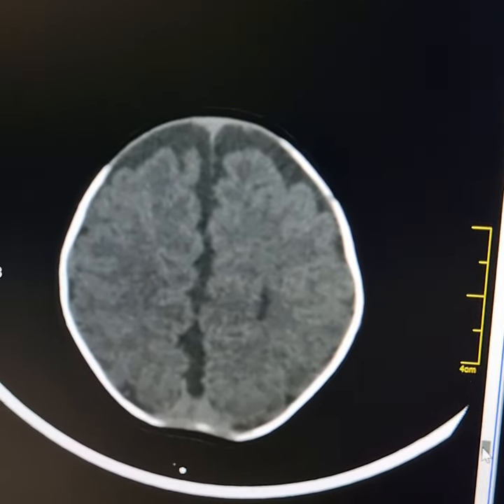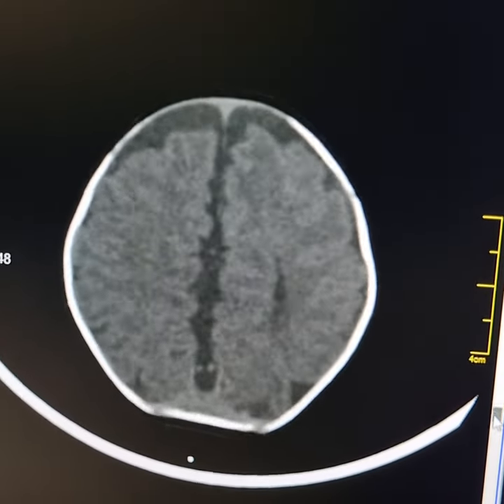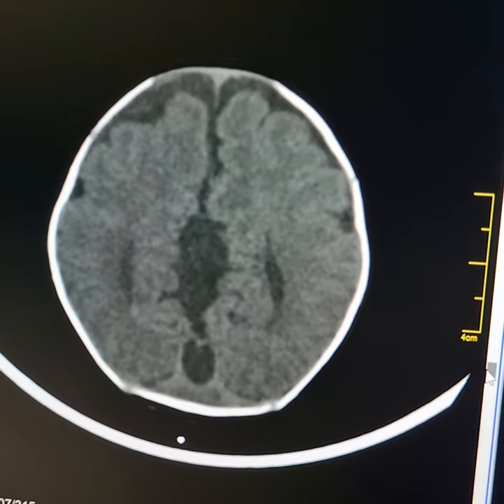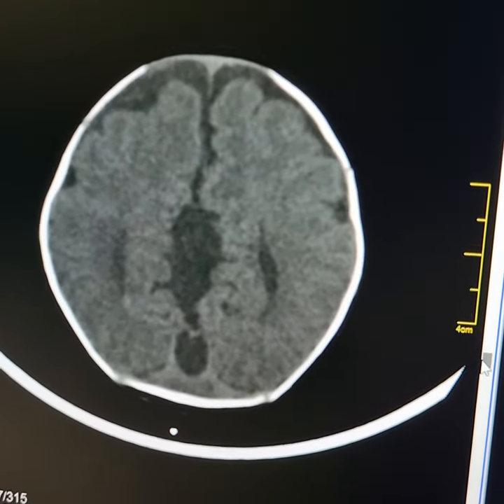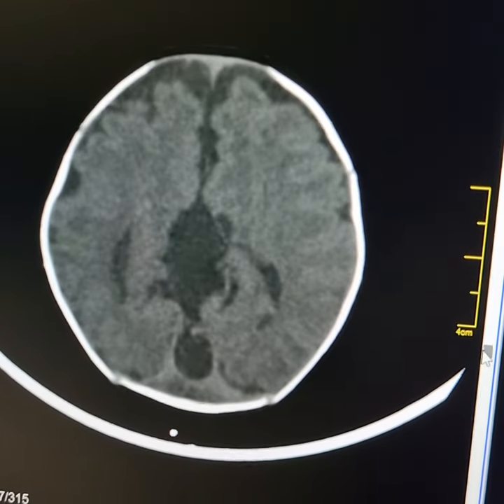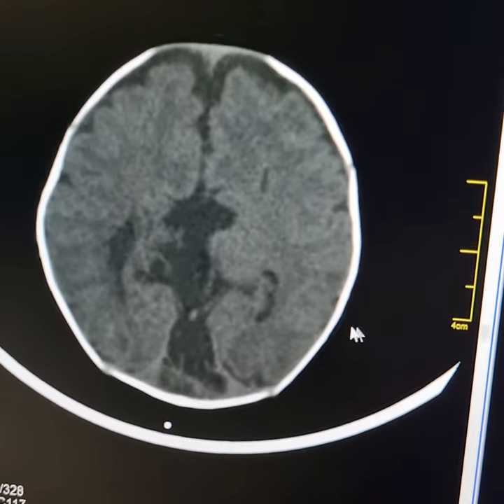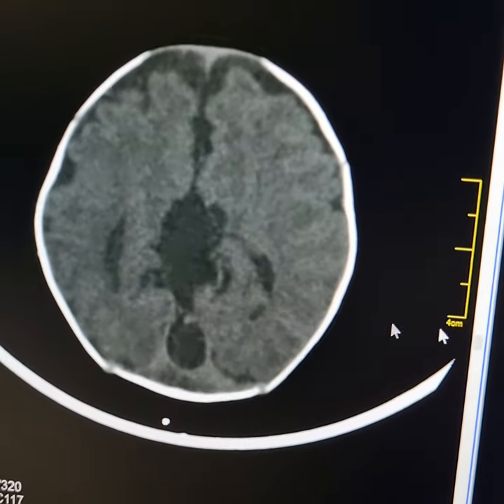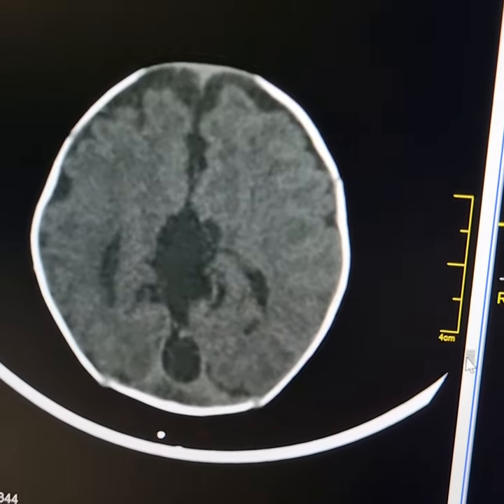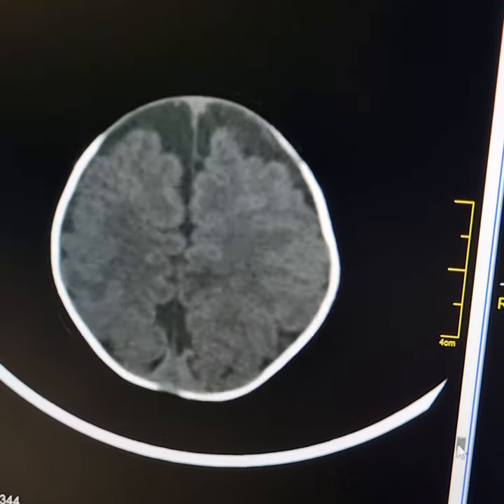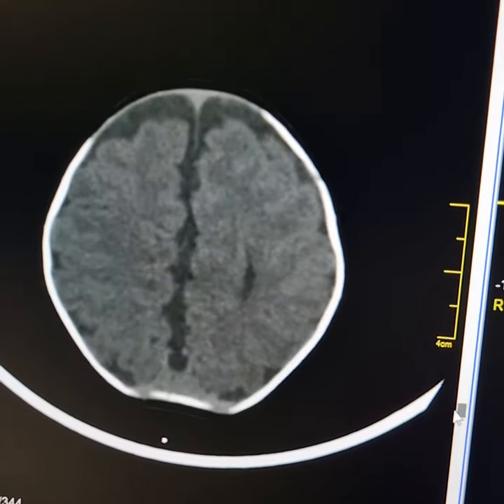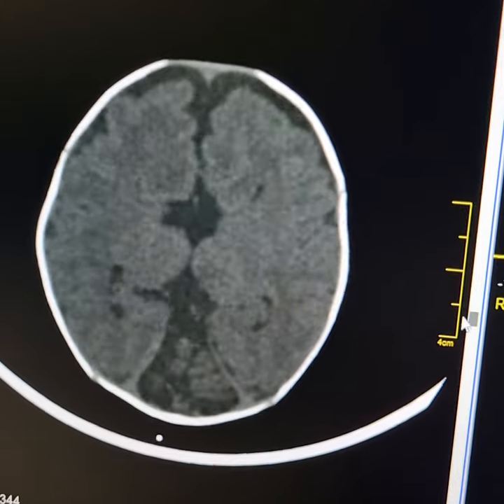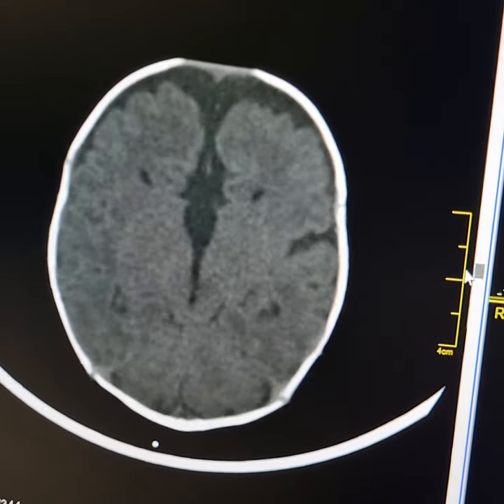In her antenatal ultrasound, this was labelled as an inter-cerebral hemispheres cyst. This is quite a typical finding in cases of corpus callosum agenesis.